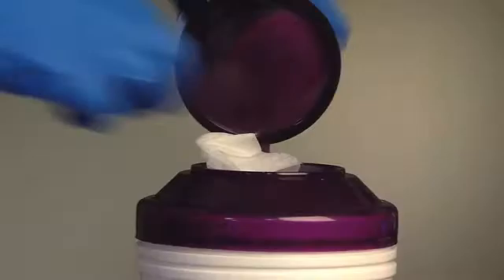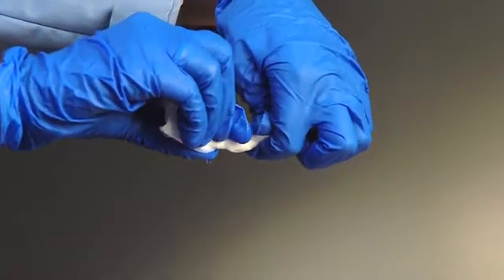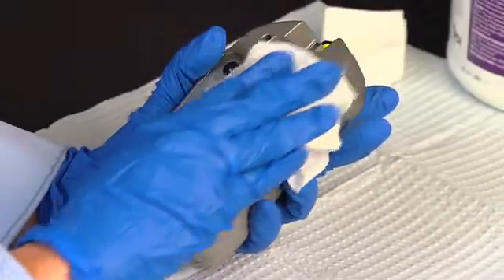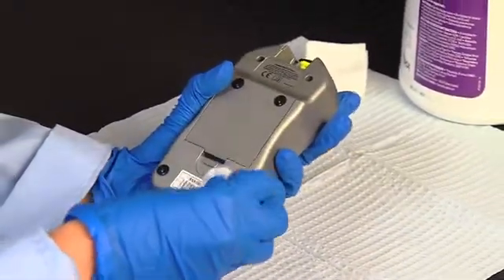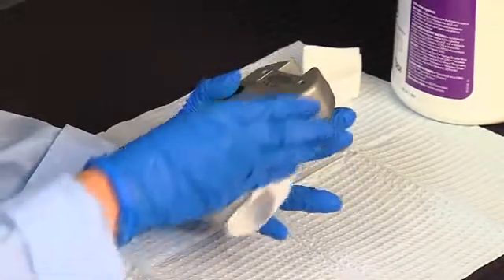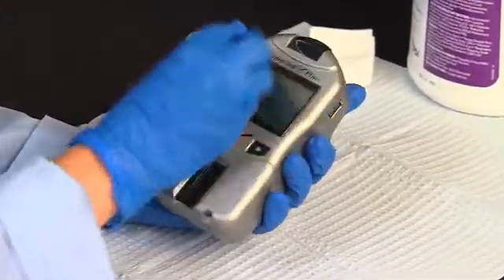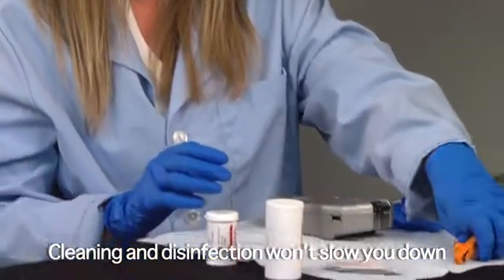Now that you've cleaned your analyzer, it's time to disinfect. Get another fresh wipe, wring out the excess liquid, and wipe the analyzer thoroughly. The analyzer needs to stay wet for two minutes to kill all blood-borne pathogens. You may need to wipe the analyzer again to make sure the disinfectant stays in contact with the analyzer for the full two minutes.